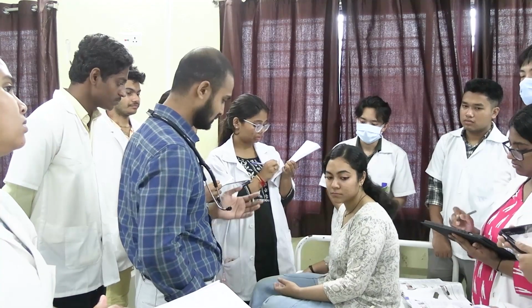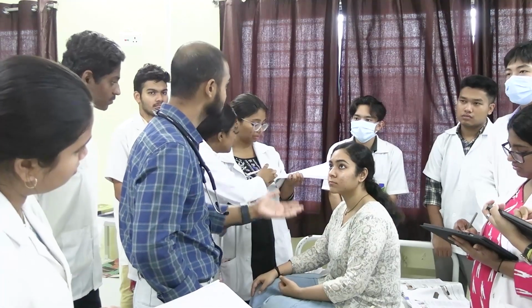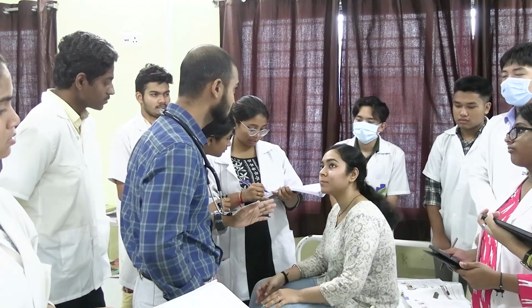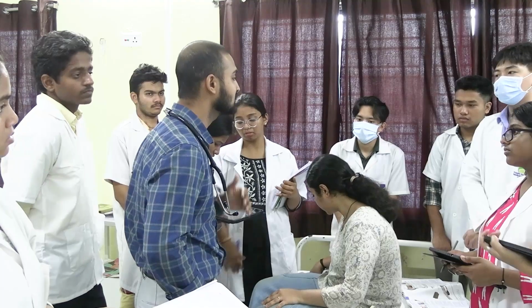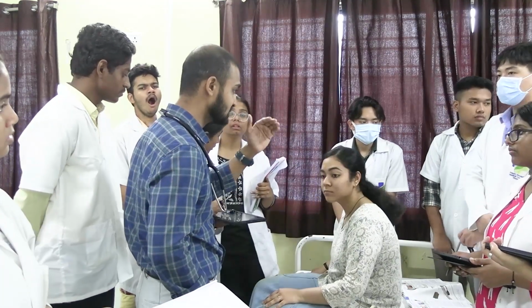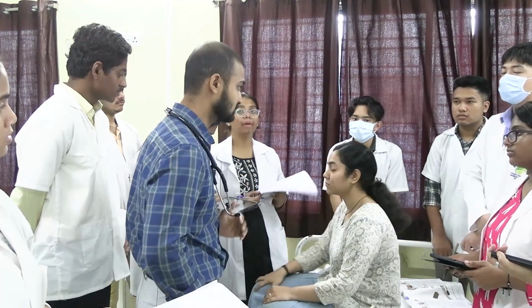So you try, as I said, and try to listen to the various sounds. First do the palpatory procedure, find the systolic, and then go for the auscultatory after confirming the systolic. Try to hear the various sounds and distinguish between them. Okay, try.